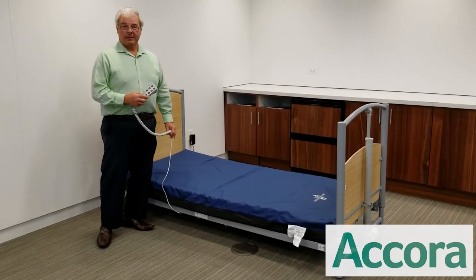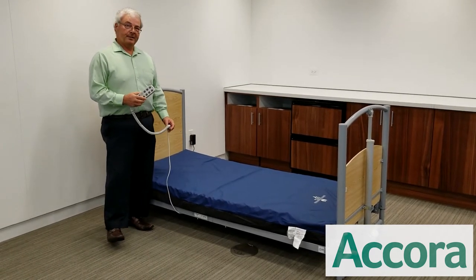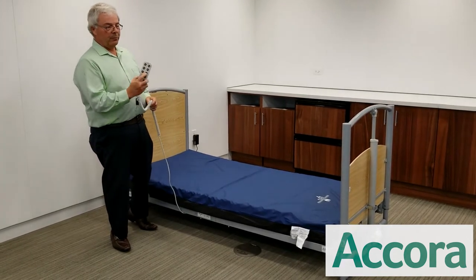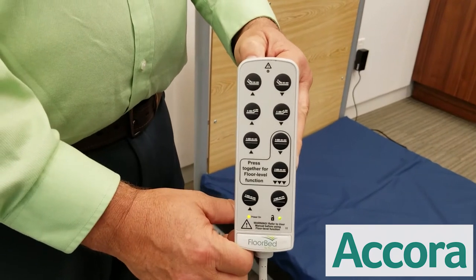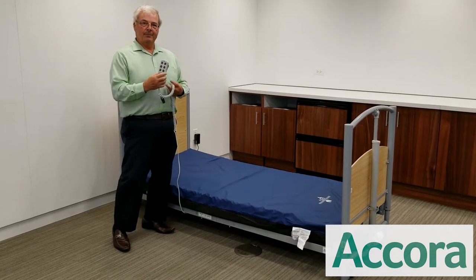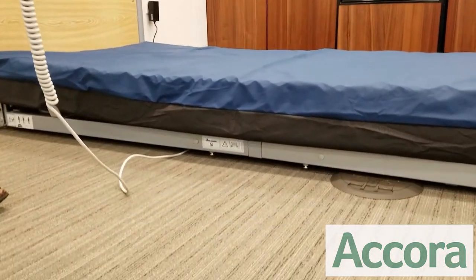Now we're going to talk about safety. The main purpose of the floor bed is to eliminate falls and the injuries that falls produce. When you bring the bed down with the handset, it will stop at a normal low bed position — in this case, eight inches. You need to make a clinical decision to make it go to the floor bed position, which is where you'd place the patient when they're unattended in the room or at nighttime.